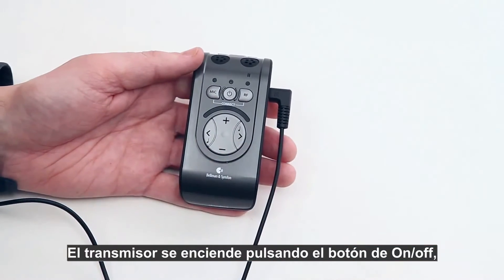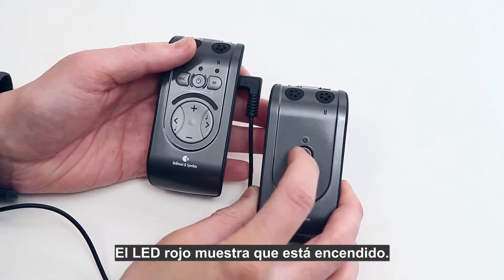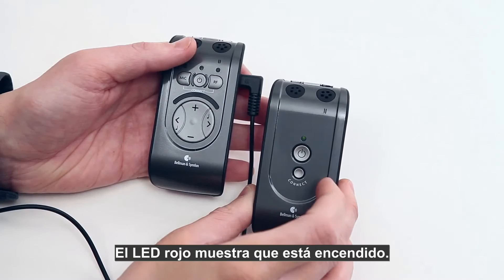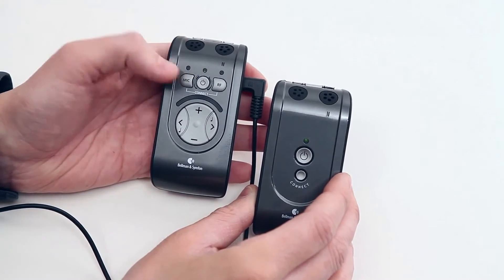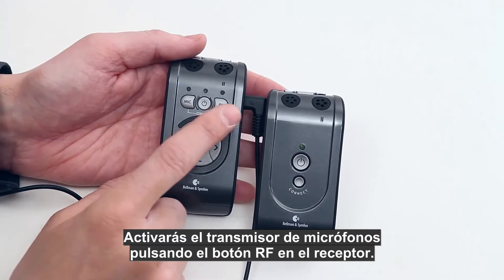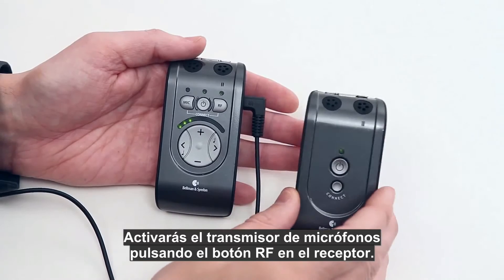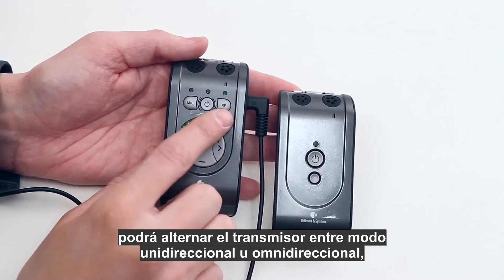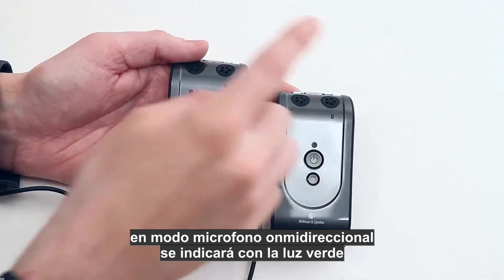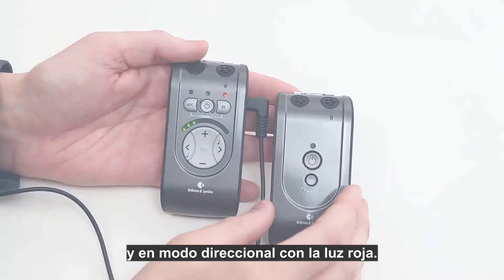The transmitter unit is powered on by pressing the on/off button — the LED flashes red to show that it's turned on. You activate the transmitter's microphones by pressing the RF button on the receiver unit. By pressing the RF button again, you can toggle between the transmitter's omnidirectional setting, indicated by a green light, and the directional setting, indicated by an orange light.